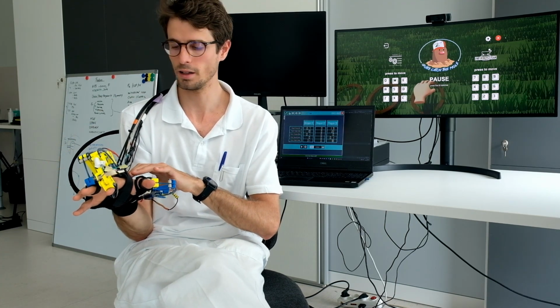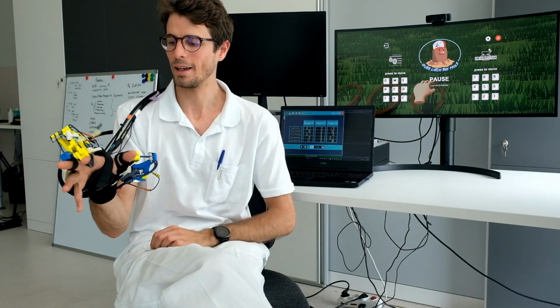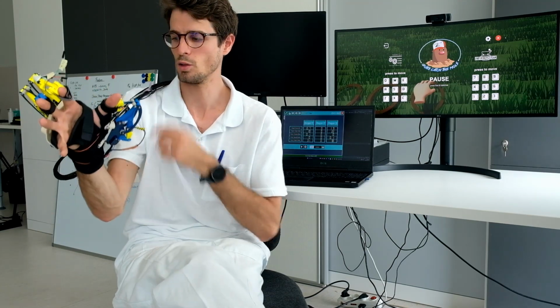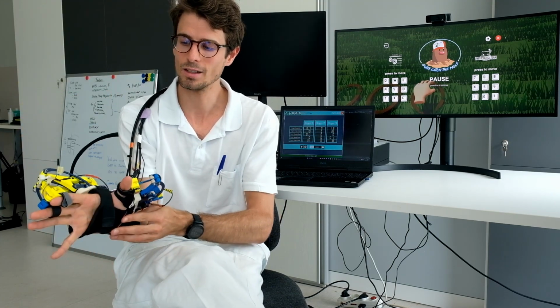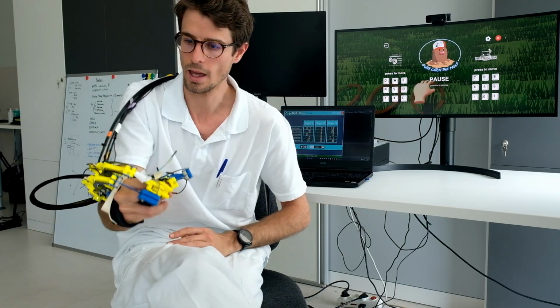Moreover, I really liked the fact that the wrist joint is not rigid, because the flexion extension of the wrist is important in reaching movements. If you want to reach for an object, for example a bottle of water, there are anticipatory strategies propedeutic to the arrival at the target. First the shoulder flexion, then elbow and wrist extension are needed to be able to reach an object and finally close the hand to bring it back to you.